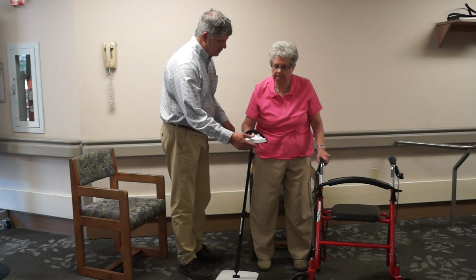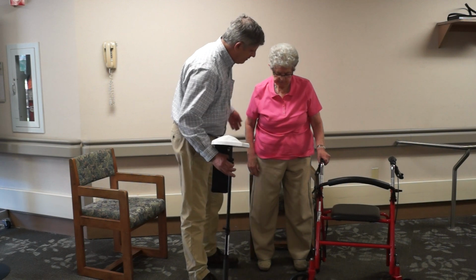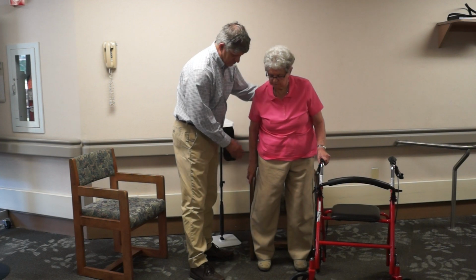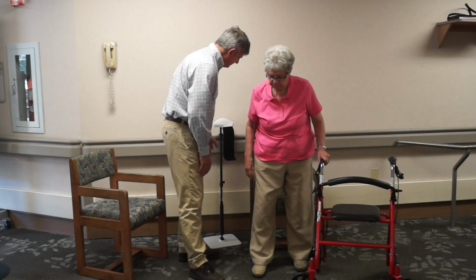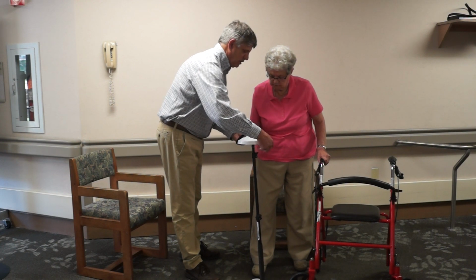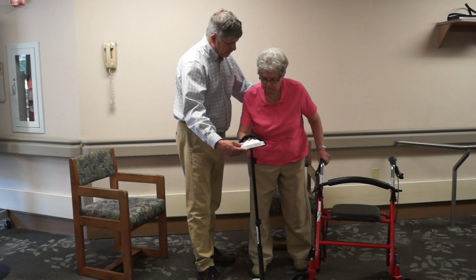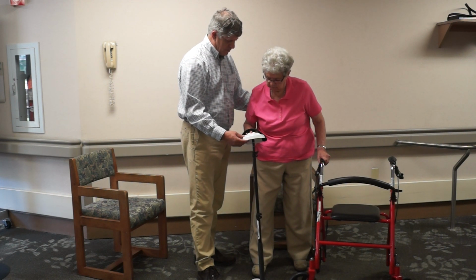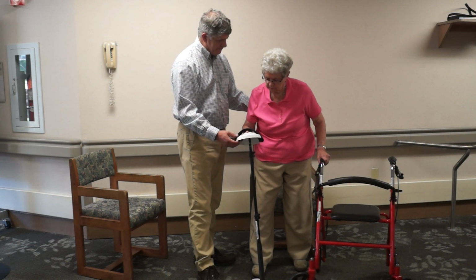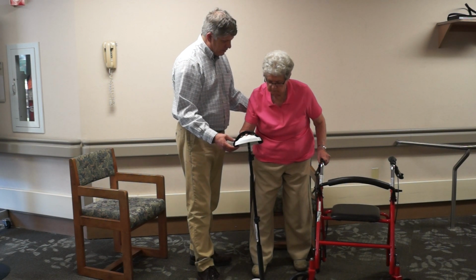Okay. Now let me ask you, let's do something just a little bit more challenging then. Okay, hang on to that, but let me ask you to take a step forward with your right foot. Okay, right there, good. Now what we can do is then reach forward, but then lean a little bit with your body. There you go, perfect. That just gives you a little bit more real estate, right? A little bit more options to get further from your usual.